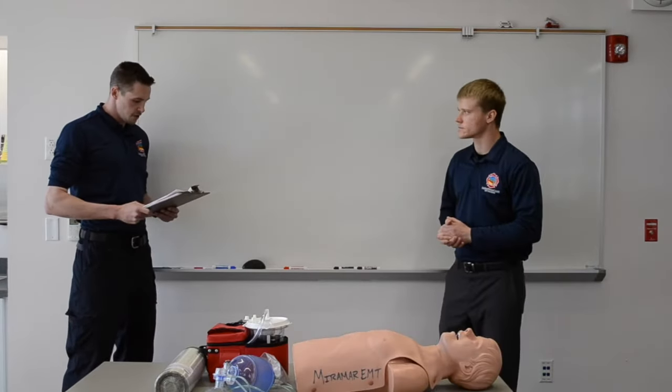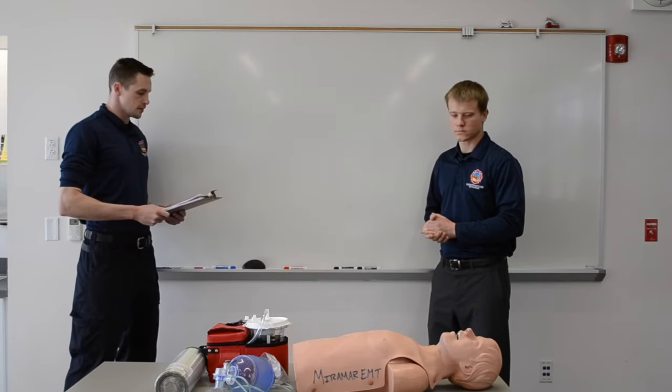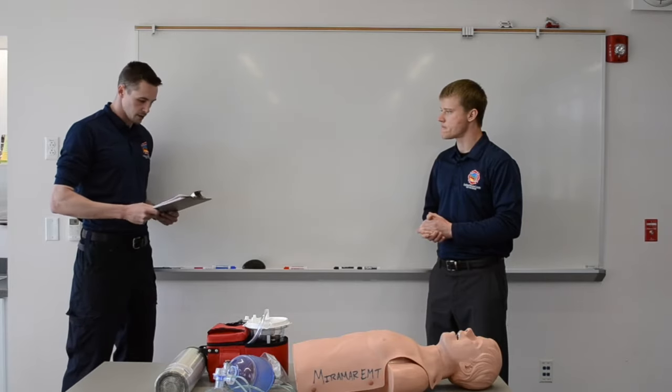Upon your arrival to the scene, you find a patient lying motionless on the floor. Bystanders tell you that the patient suddenly became unresponsive. The scene is safe and no hemorrhage or immediate problem is found. You have five minutes to complete the skill.